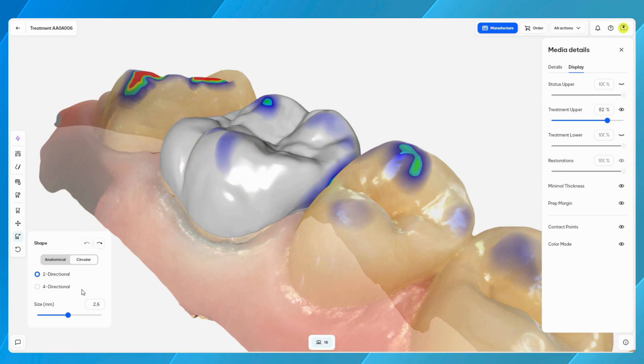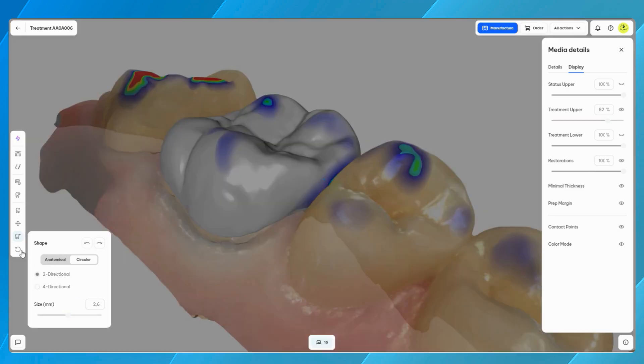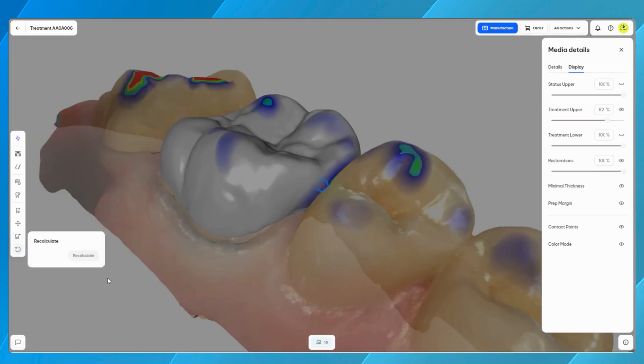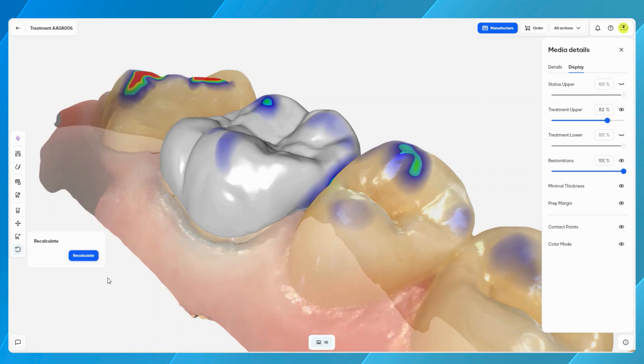The recalculate tool is the reset button. In case there is a need to start over, simply press recalculate and the algorithm restarts the calculation and removes all manual adjustments.